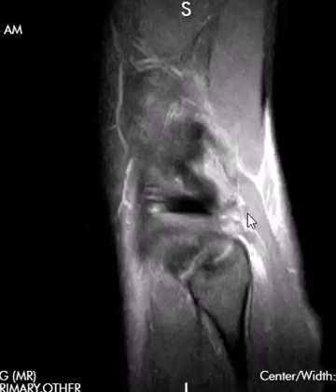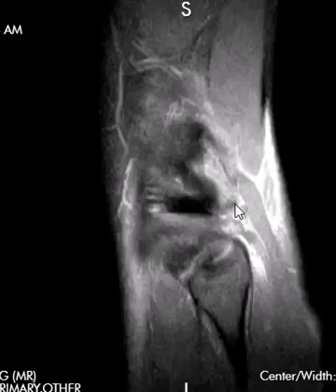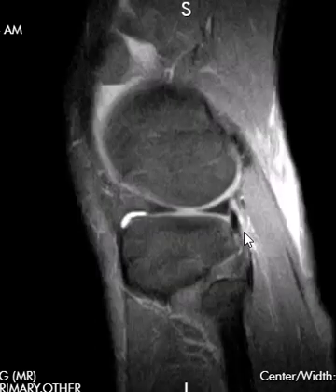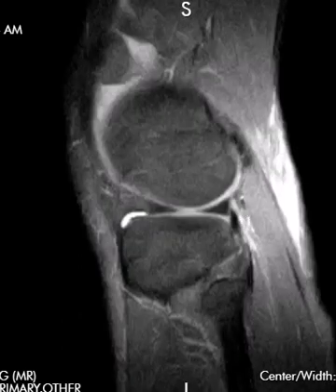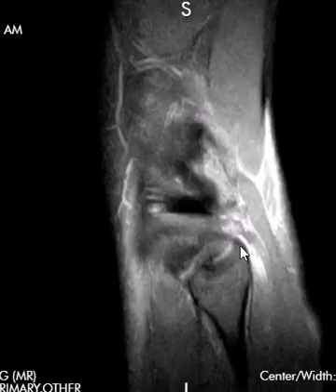Surrounding the popliteus tendon, we have the popliteofibular ligament, which wraps around it and holds it tight. There is some bright signal around the outside of it. Right where we'd expect to see a really dark band or clean soft tissues, we see brightness and irregularity. I believe the popliteofibular ligament is torn. If we look at the fibular styloid and go to this cut, we should see something coming up vertically behind the popliteus — and we don't see it. So I believe the popliteofibular ligament is ruptured. We'll look on the coronals as well.